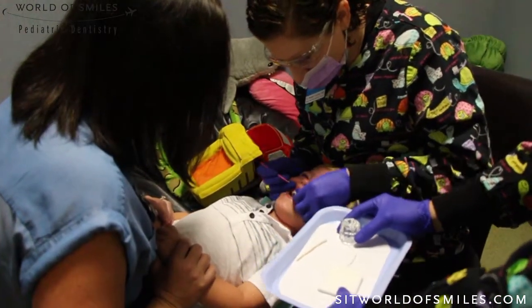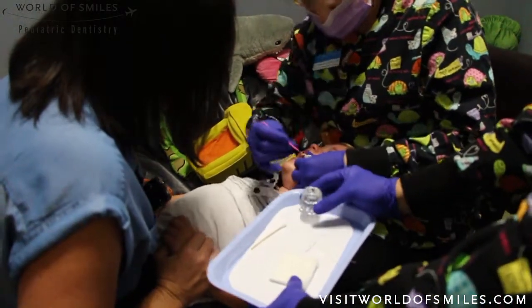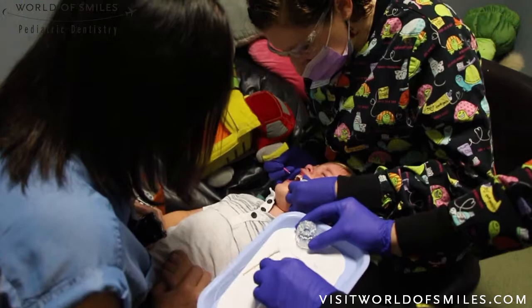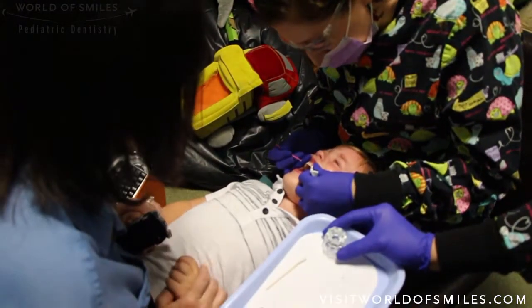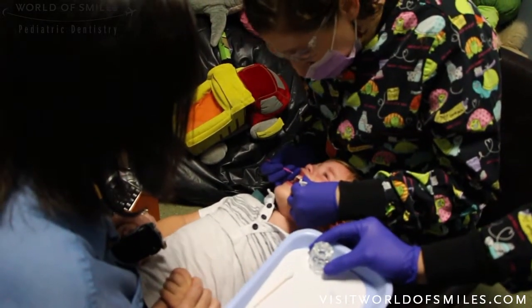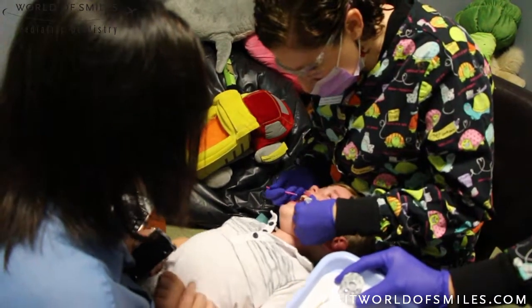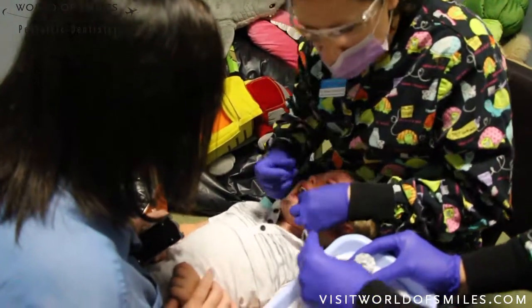Try to use the applicator brush to only paint onto the carious lesions. The trick is to keep it isolated for about 10 seconds. I generally sing or count to 10 slowly and try to keep the child as entertained as possible. Once you've made it to approximately 10 seconds, dry the area again to wipe off any excess silver diamine fluoride.